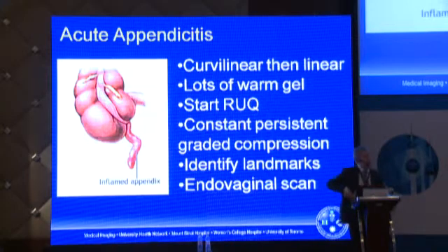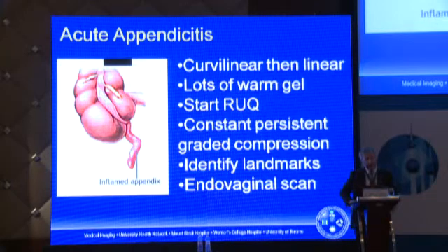And I know that the ascending colon is retroperitoneal, usually on the right side. It's the most lateral gas-filled bowel loop that runs vertically down the right flank. And that's what I try to find in transverse. And then I follow it down, and I hope that I can see it end somewhere in the right lower quadrant, suggesting that the cecal pole is high. If that's the case, I have a very good chance of finding the appendix.